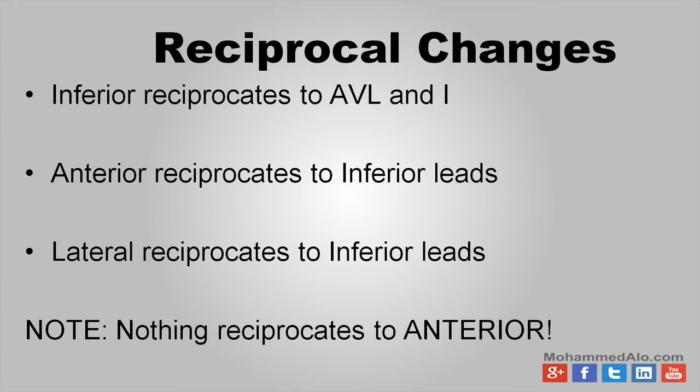There's no reason to flip the EKG paper up in the air and look through the light and do all these silly things. Just imagine what the patient's family is going to think of you. If you look at this EKG and you flip it over and you're looking at the light, they're like, what are these people outside the door doing? Are they confused? Are they not doctors? Don't they know how to look at an EKG? I mean, what's going on here? Somebody tell me something. So let's not do that.